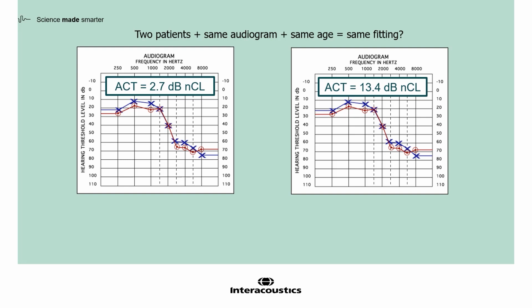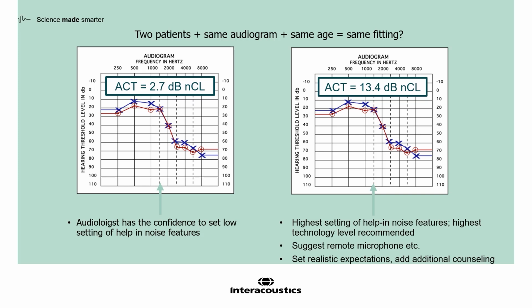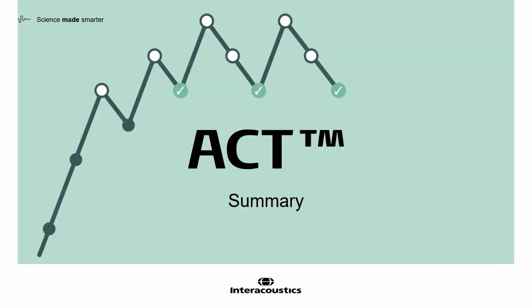If we think about fittings as they exist today, 2 patients with the same audiogram, same age, etc., would likely leave an office with the same help and noise settings. With the introduction of ACT, we can now be confident on when we want to pull down on some of those advanced adaptive features, and perhaps crank these features up for some patients, meaning 2 people of the same age with the same audiogram will leave the clinic with 2 different and customized fitting setups from the very beginning, which in turn will improve the first fitting.